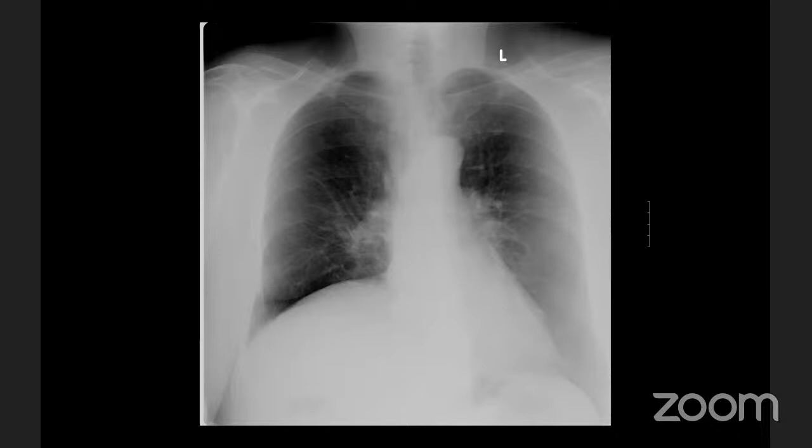In this case, there is a part of the lung missing. This is a patient after lobectomy. When you remove one of the lobes of the lung, it looks like that. The truth is that you usually don't need to diagnose this in practice. You usually know the history of the patient. You can just ask the patient, did you have lung surgery? And the patient usually knows that.